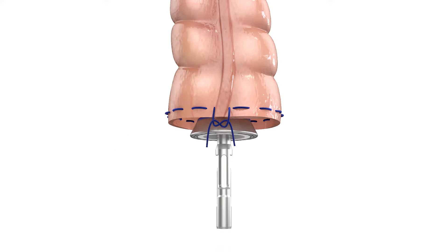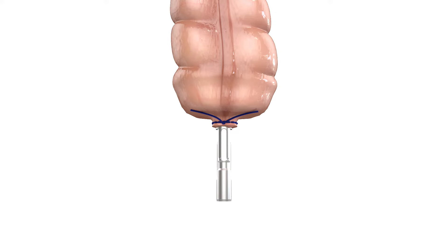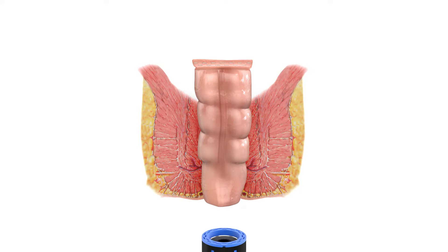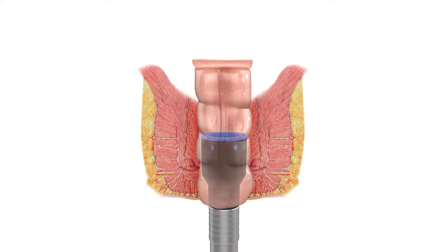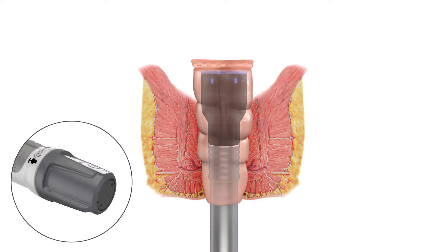Insert the anvil into the lumen using either the open lumen purse string technique or the closed lumen stapling technique, ensuring that the tissue is located at the suture tying area. With the anvil removed and the device trocar retracted until it is no longer exposed, insert the device so it fits snugly against the distal transection site.